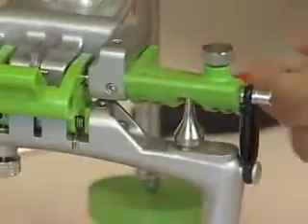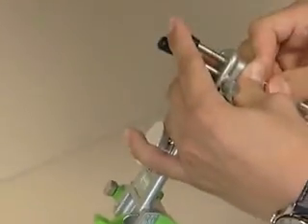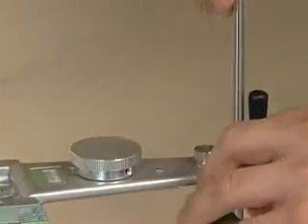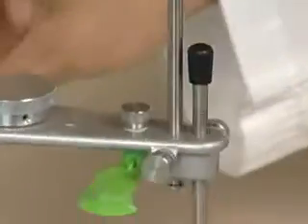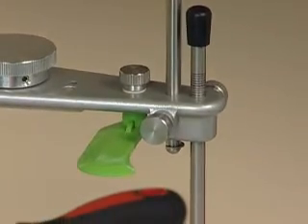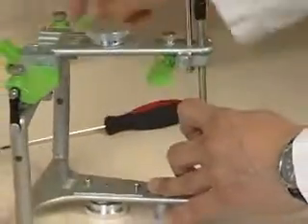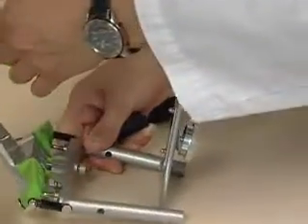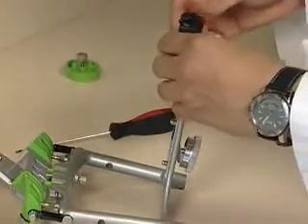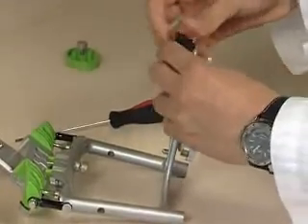We want to set the incisal guide pin so you just barely see the green mark, which means that the upper member of the articulator will be parallel with the lower member. The next thing we have to do is change the incisal guide table and put in the mounting table. Be sure and slide the mounting table all the way back until it makes contact with the bottom frame of the articulator.